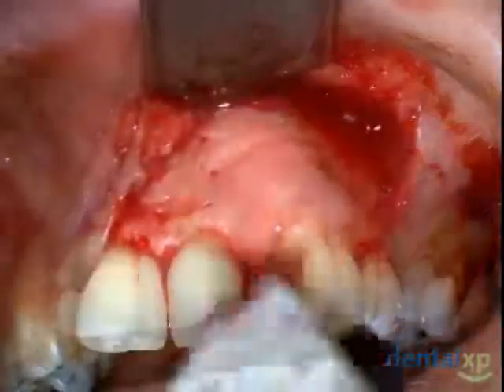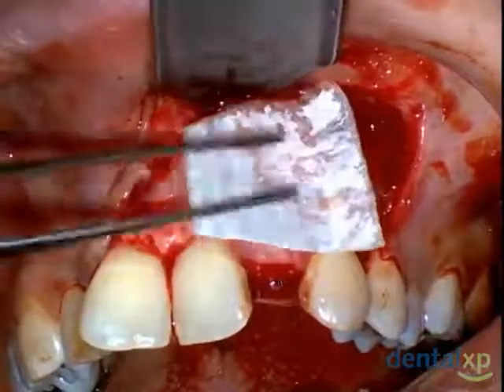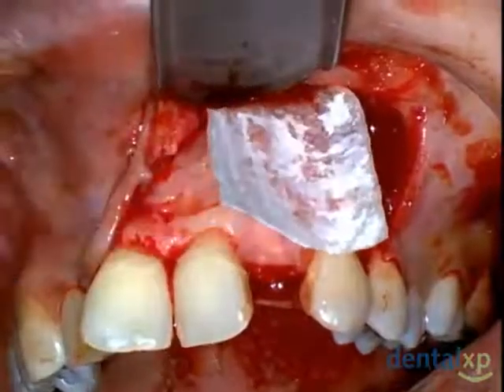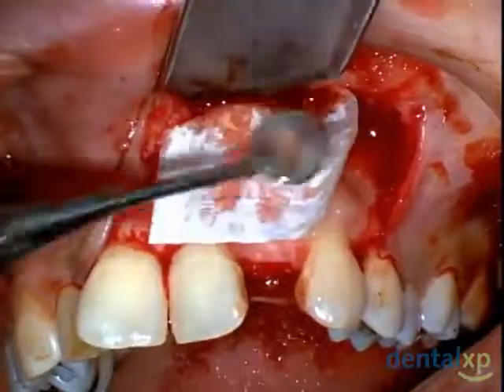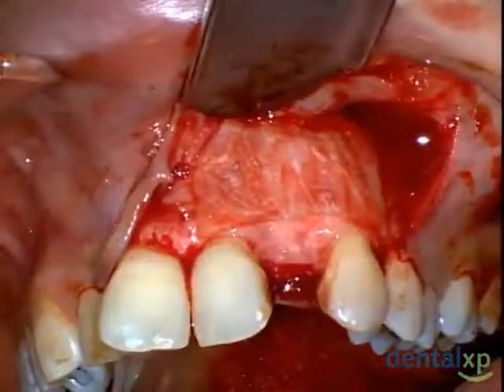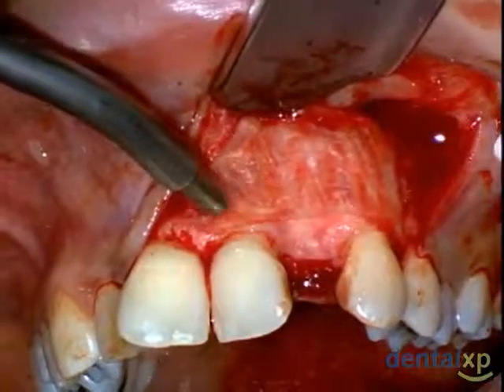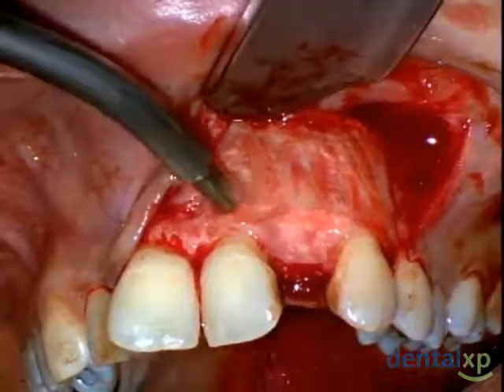As I said before, one of the nice things about PRGF is that it's taken from the patient's blood with a minimal cost, approximately $15 to $20 per patient. Because we want a longer-term barrier function, we went ahead and decided to add a collagen membrane. In this case, this is a Memlock membrane from BioHorizons, and we're going to also use the BioHorizons AutoTac kit to secure the membrane.